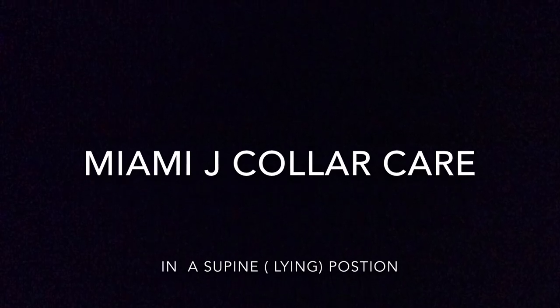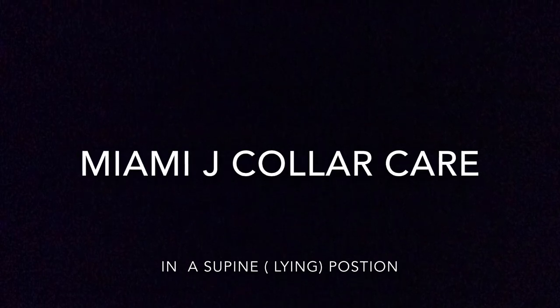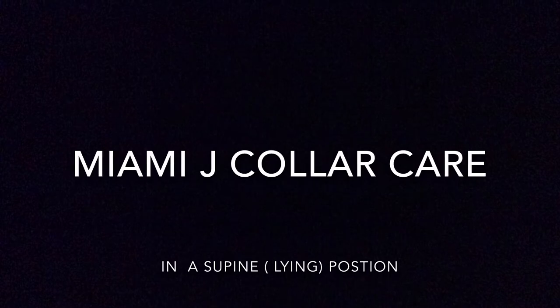This short video explains how to perform collar care with patients wearing a Miami J cervical collar. Collar care is extremely important to prevent breakdown of skin and avoid pressure areas developing. It's advisable when performing collar care for the first time to do this with the patient laying down supine.